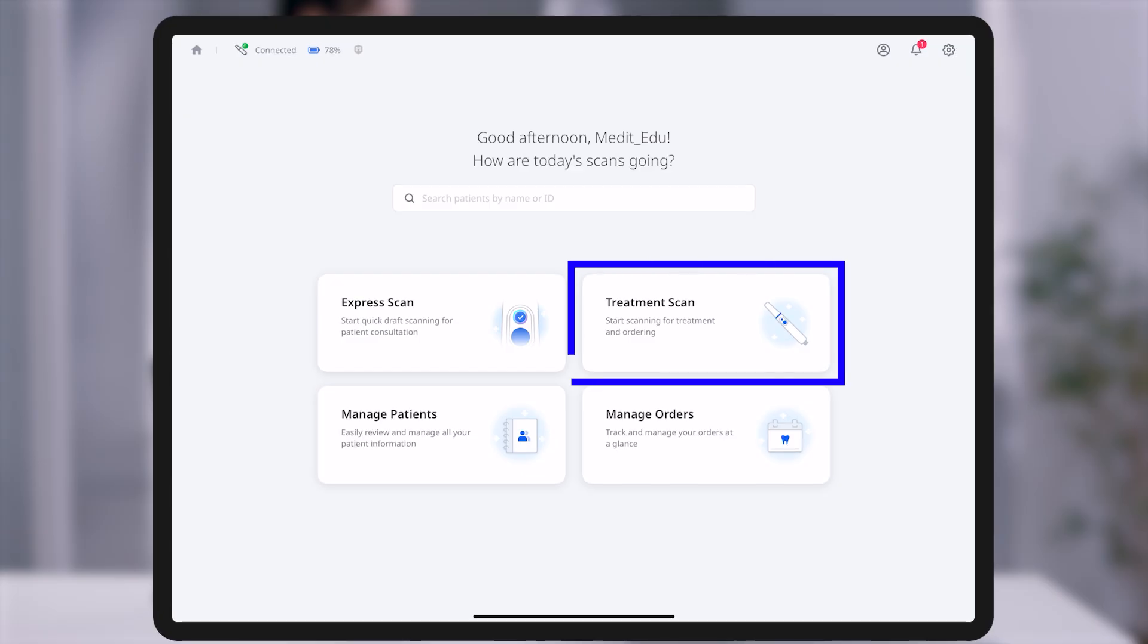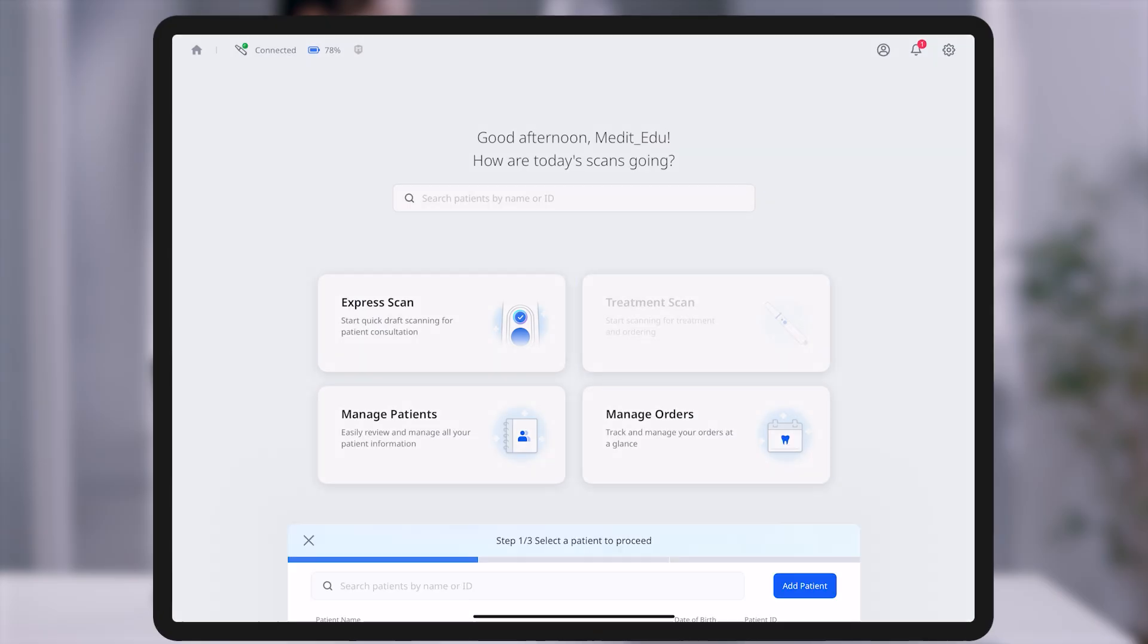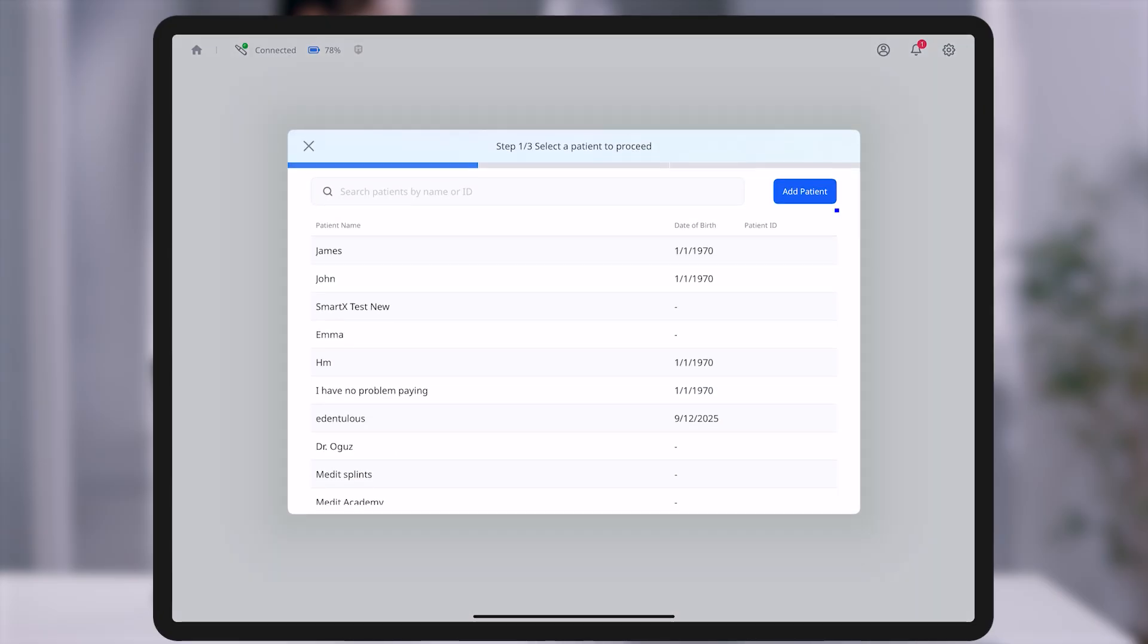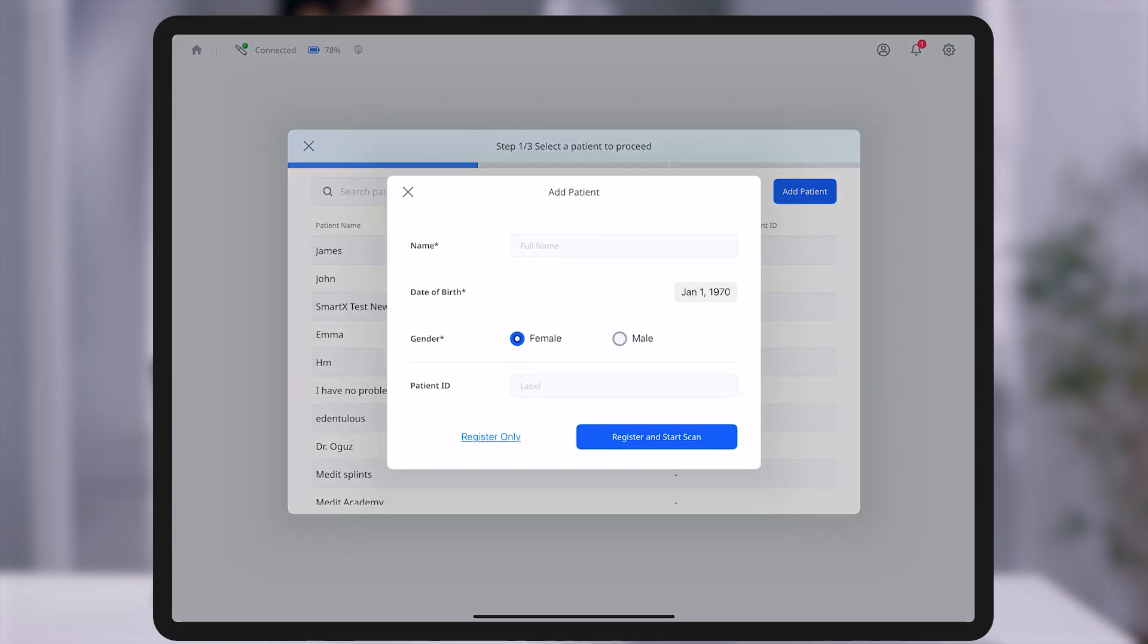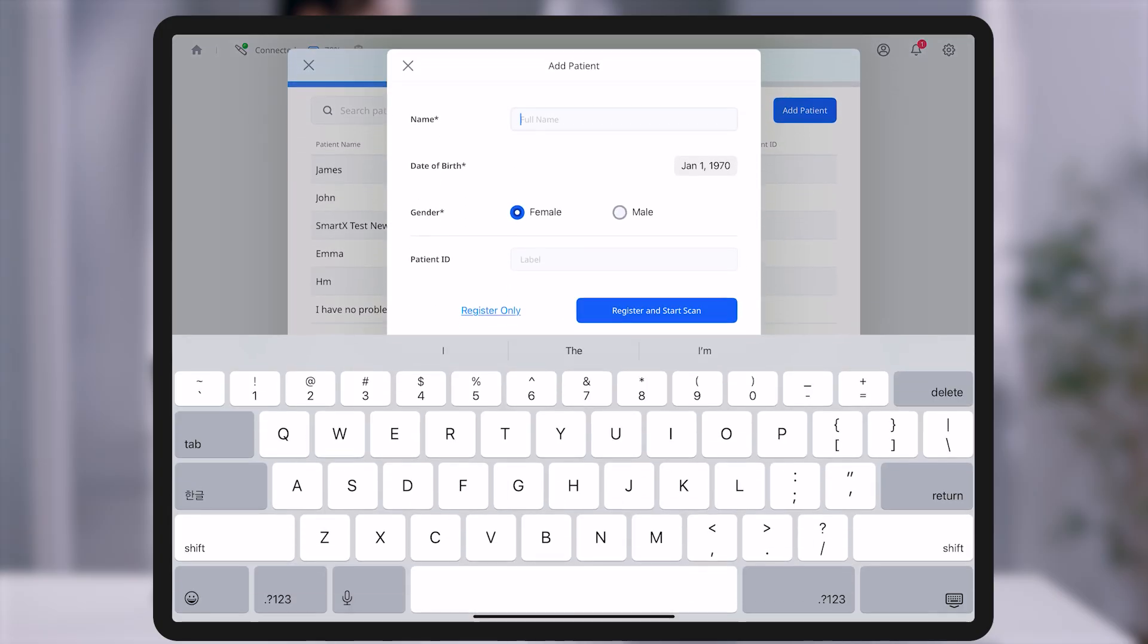When starting the treatment scan mode, the first step is to select a patient. You may choose from previously registered patients or register a new one.